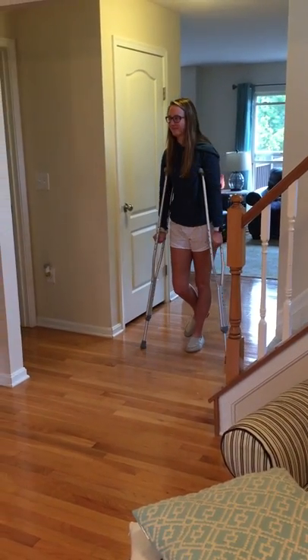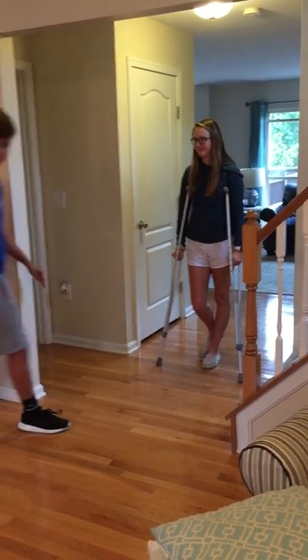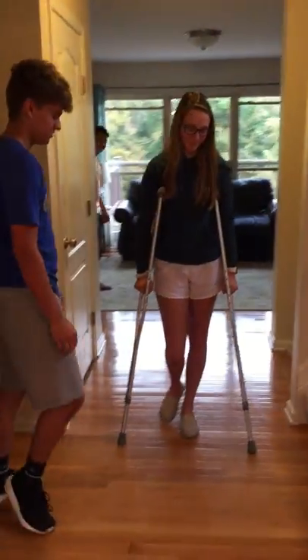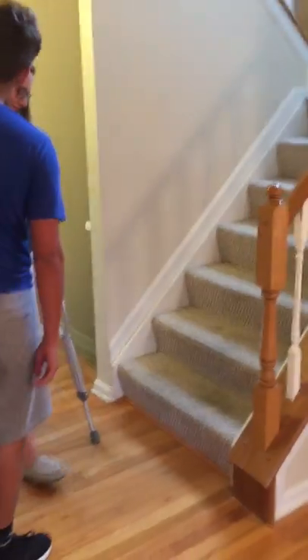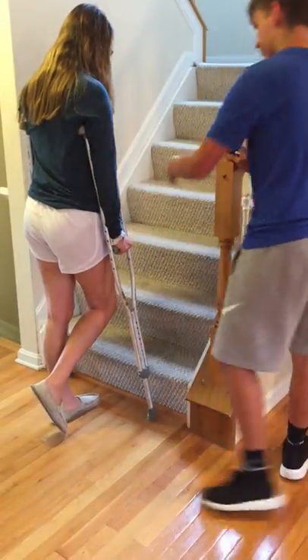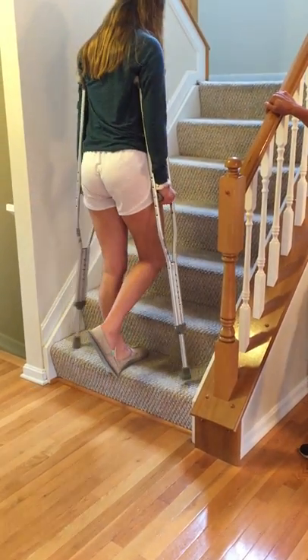Now turn around. Alright, you come this way sir. And now we're going to show you how to go up the steps. So you want to put both of the crutches as close to the step as you can. Put pressure on your hands and put your foot up first. And then bring your crutches with you.